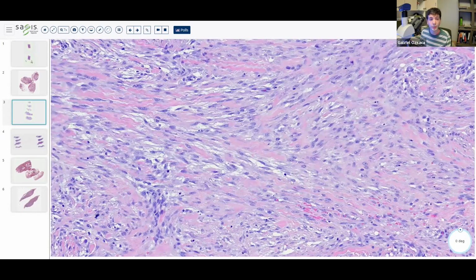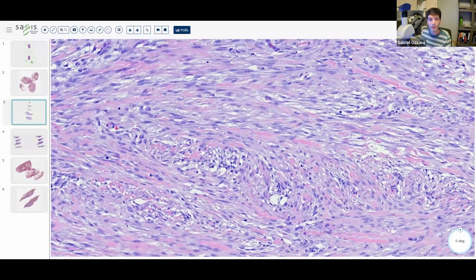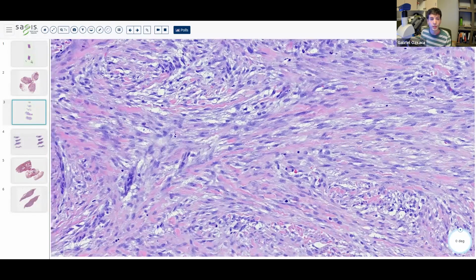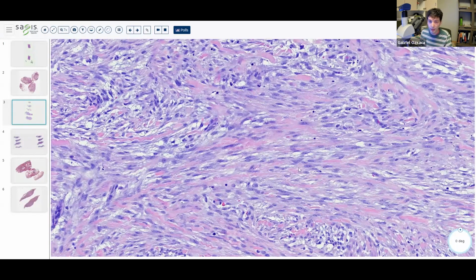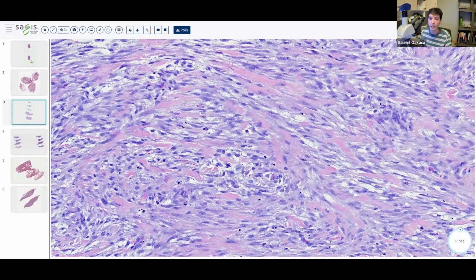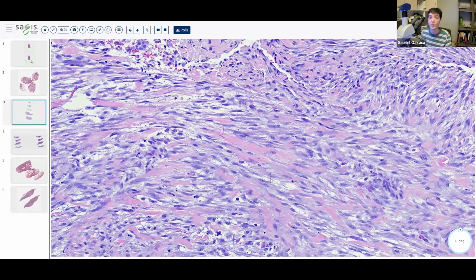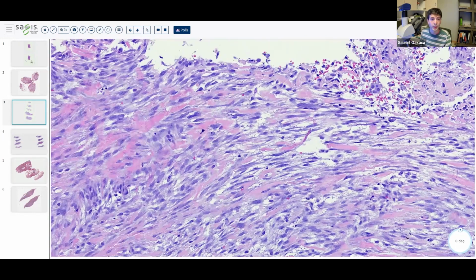And then some of them have a pulled-apart appearance. I'm trying to find a particularly good example of one, but this is what's described as a tissue culture-like appearance, this stringiness to it, where you could see the cytoplasmic processes of the cell being pulled in either which way. It's most easily appreciated whenever you have one that's being pulled in 3 directions, and it is described as a stellate fibroblast, because it looks a little bit like a star.